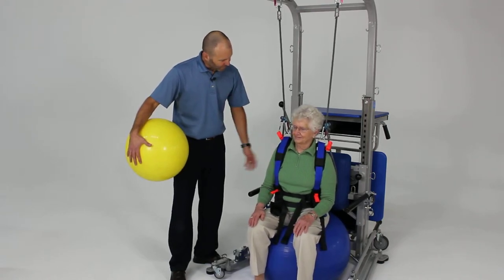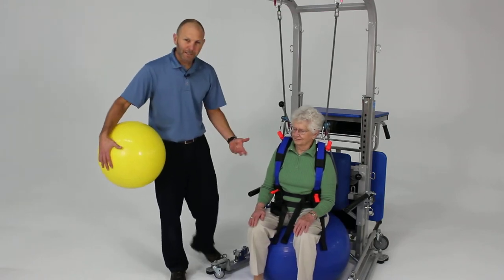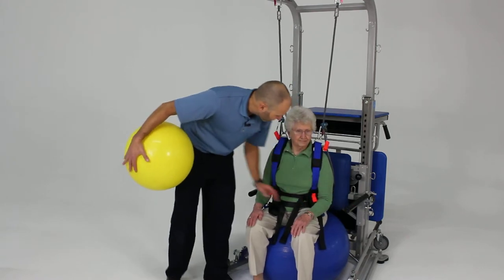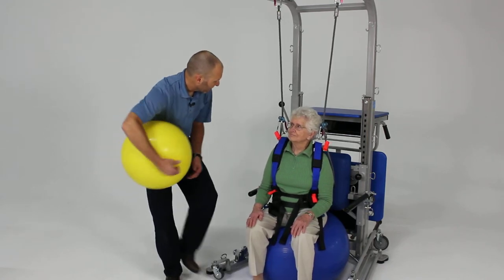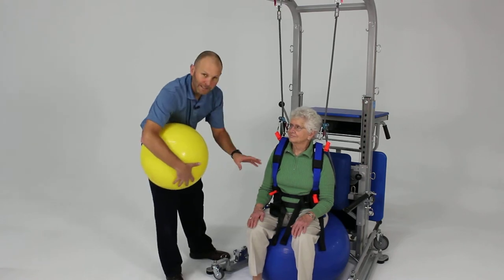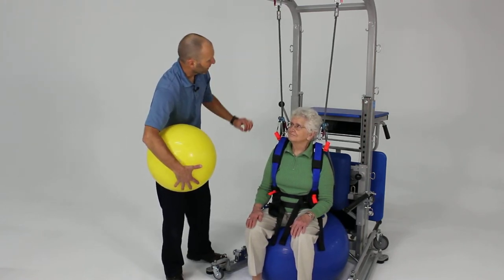Now we're going to make this even a little more difficult by adding some actual movement of her upper extremities and some catching of the ball. She's got the arm supports here, which give a little bit of security — that may be the way we start until she gets some comfort with that. But these can then flip up out of the way if you want to take that support away, and you still have the support of the safety lines here to give her some checks of her movement.